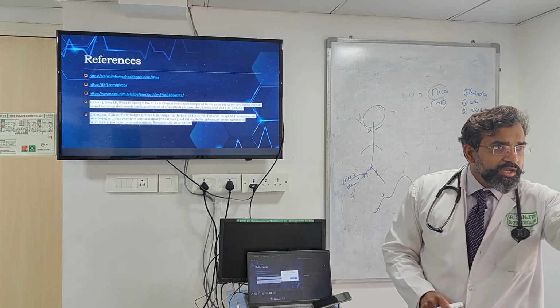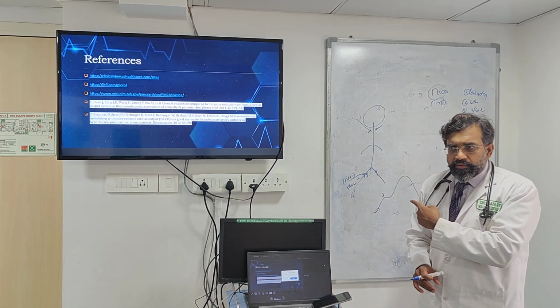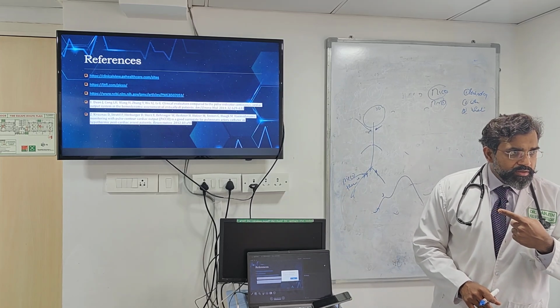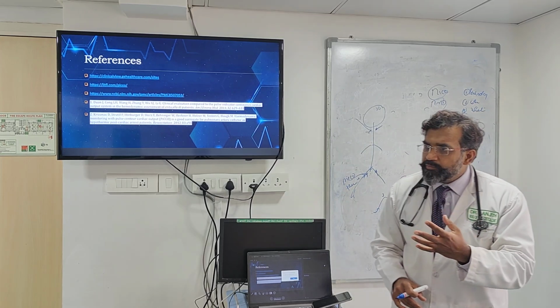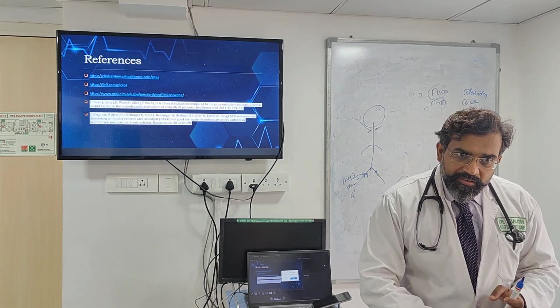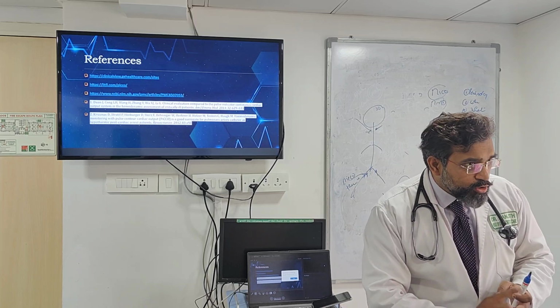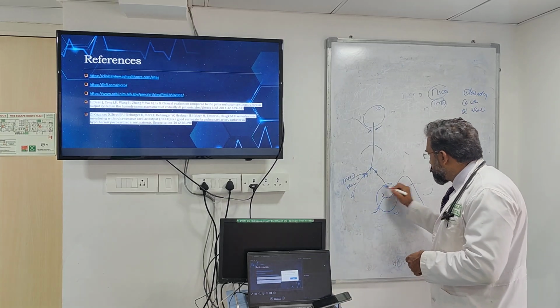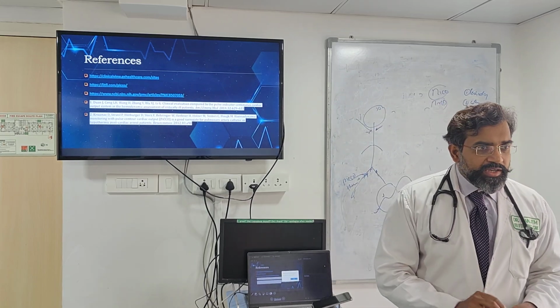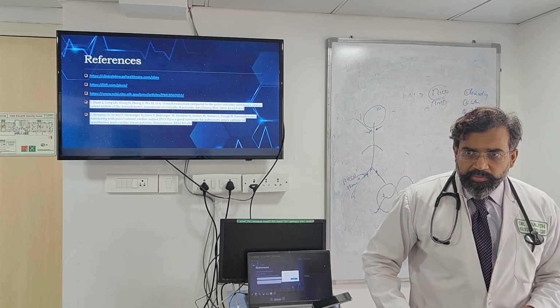So you must be careful with this. Why will this hump otherwise occur? This hump will also occur when there is a patent foramen ovale. You understand? When there is a patent foramen ovale, what will happen is the indicator you are giving to the right ventricle, there is a movement of blood between the right and the left ventricle, which will actually cause something like this. So I must be certain that this is not a patent foramen ovale. Okay, this is basically the hump coming from here.